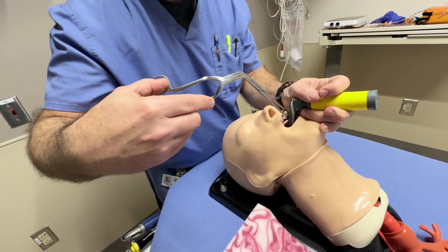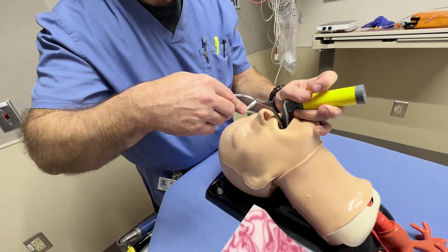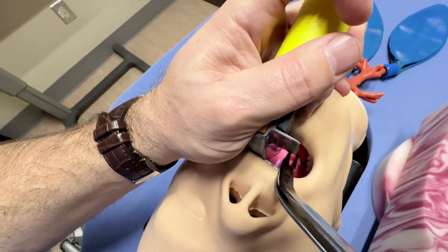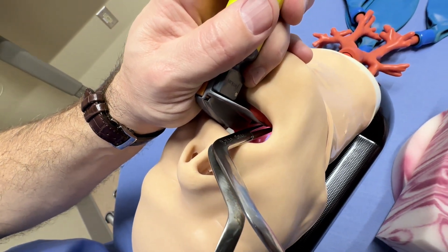Absolutely — you'll be obscuring the view that you're trying to obtain with your operating hand. It's a right-handed tool, left-handed laryngoscopy, and as I use it here, I have an unobstructed view of the tool's jaws in the oropharynx, and my hand is nowhere to be seen. It's completely out of view.